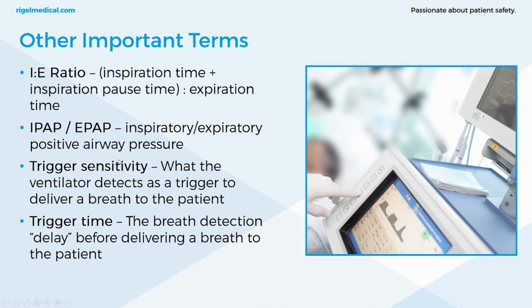But what about EPAP? Is that not just PEEP? Because it's the baseline flow. In most cases it is. So PEEP is often the same as EPAP, particularly with invasive ventilation. Not necessarily with non-invasive, because the baseline pressure is not necessarily just what comes from the ventilator. Your EPAP is your applied baseline pressure.